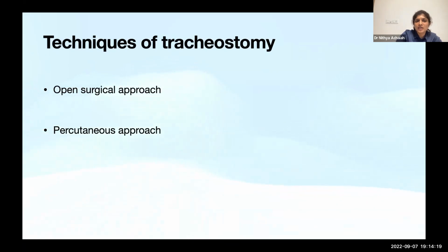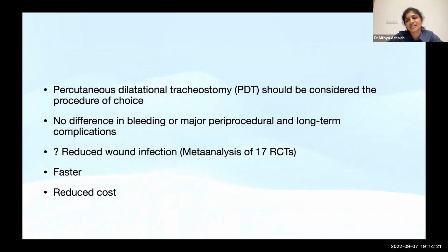So which technique do we go for? This depends on your institutional preference and your expertise in this procedure. But nowadays, more and more places are going for percutaneous dilatational tracheostomy, and probably in future this will be considered the procedure of choice. The studies have not shown any major difference in the bleeding or long-term complications between the two procedures, the open surgical approach or the percutaneous approach.